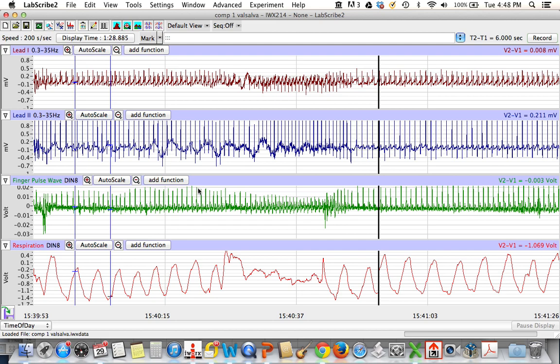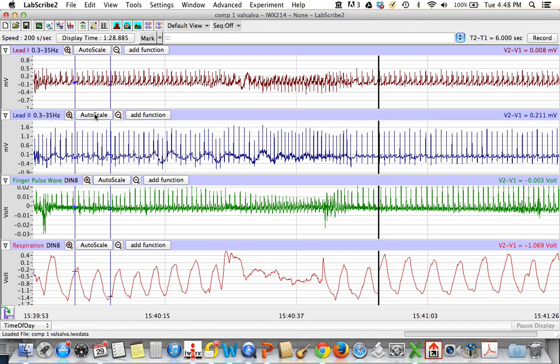And also the size of the pulse wave drops precipitously here. And then the density of the EKG spikes here is much greater. So there's obviously a pickup in the heart rate in this case. So this is beautifully done, looks really nice. And so we should be able to monitor it.